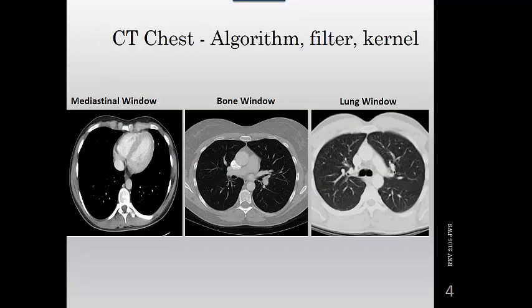So the CT thorax is normally displayed in mediastinal and lung algorithms. The lung algorithms, obviously, are to view the lungs, but you need to understand the difference between air-filled bronchi and contrast-filled vessels. Just like on a plain chest x-ray, the bronchi are too thin to show. So the so-called lung markings are really blood-filled vessels. And these are the solid white anatomy that you see dotting the lung field on the mediastinal algorithm. On this image here, these little white dots are vessels that are filled with blood.